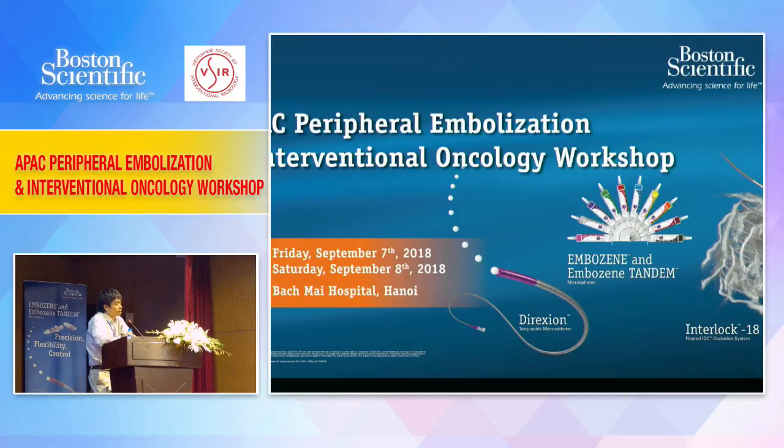And another embolic agent we have not yet performed is alcohol. In case of a huge arteriovenous malformation, you can try alcohol. I don't have experience, but I heard about that. So maybe you have some experience.